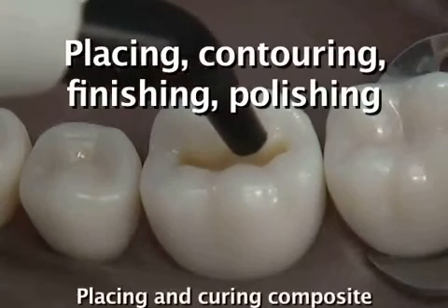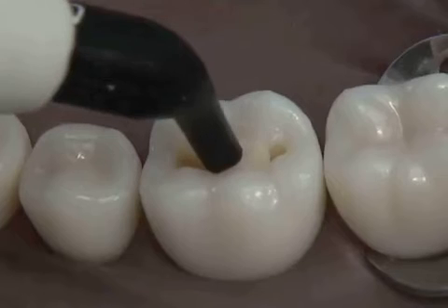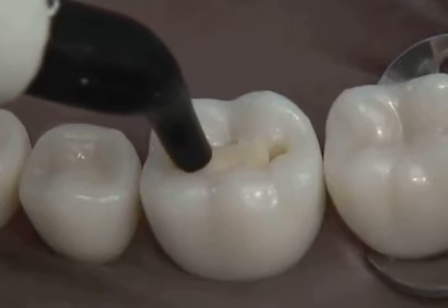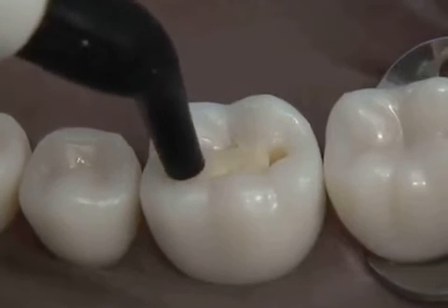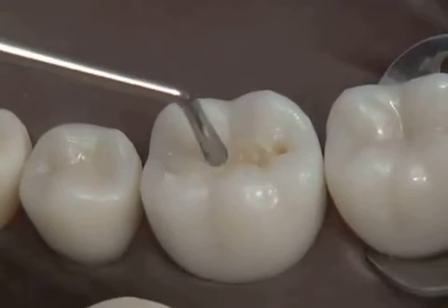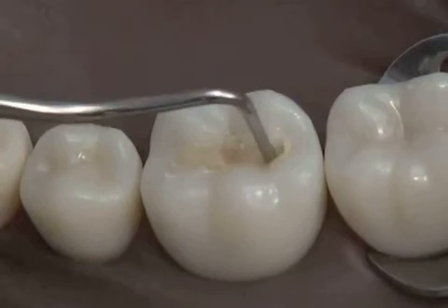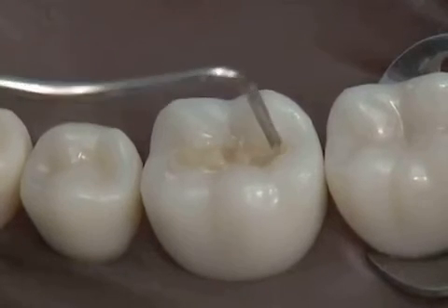Place the composite via a composite gun or hand instrument directly into the cavity preparation. This should be no larger than a 2x2 mm glob of composite, unless it's a special bulk fill material. Pack the composite with a blunt hand instrument to ensure that there are no voids along the pulpal floor.